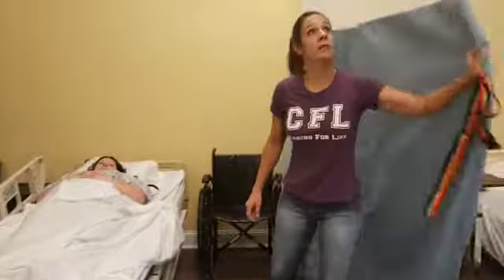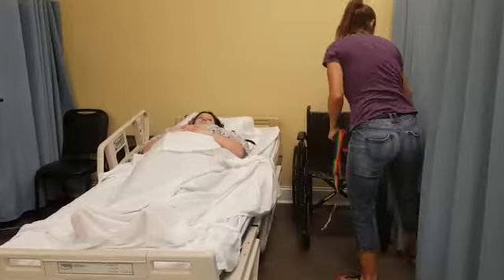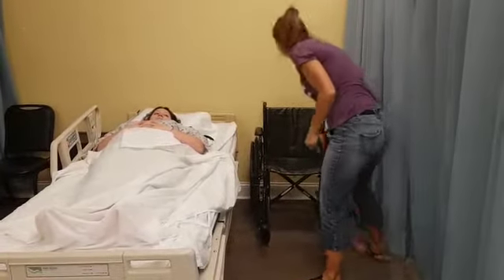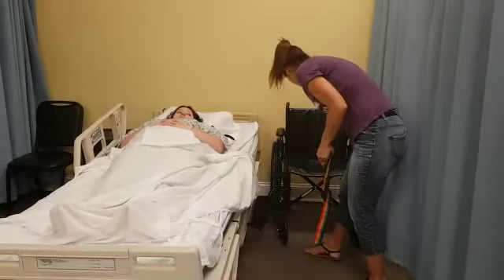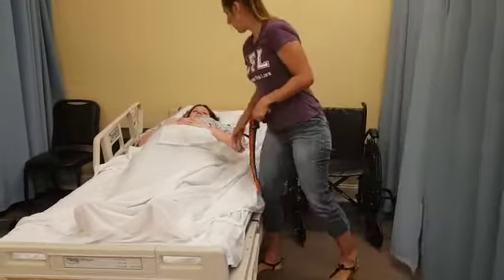This one requires privacy all the way around. I'm going to go ahead and lock the wheels. My footrests are out of the way. Okay, my bed is locked.